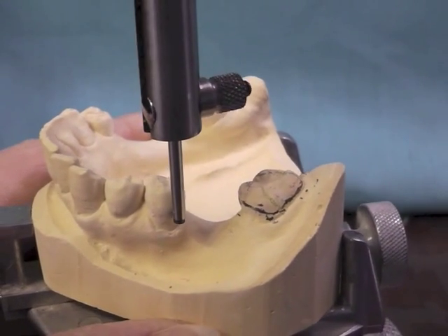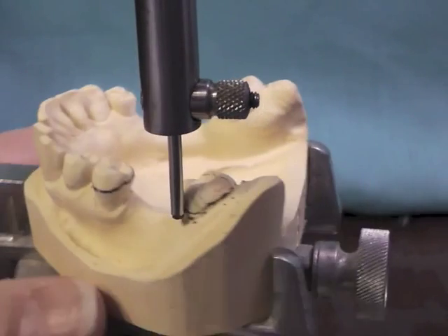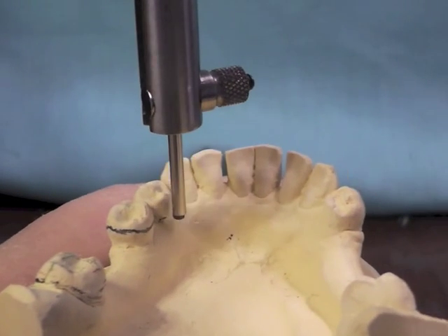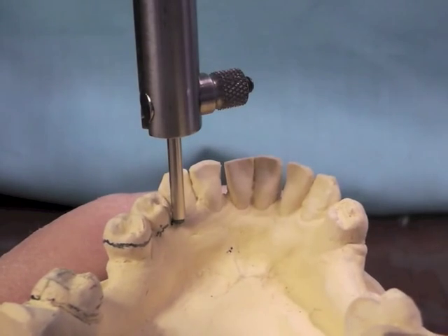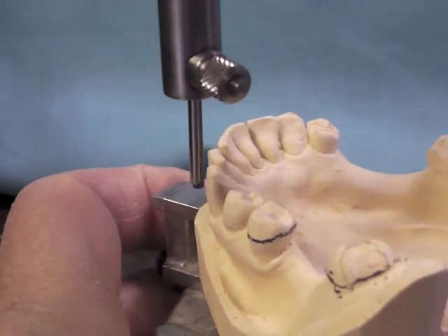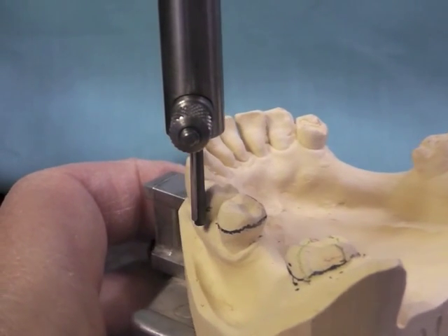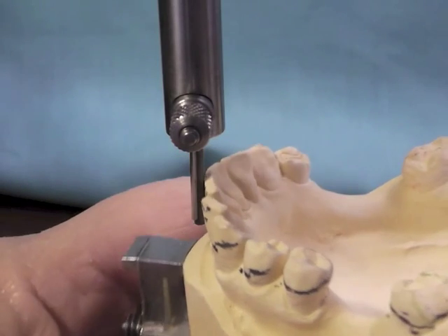We survey all posterior teeth and any teeth next to an edentulous area, and I like to survey anything that metal may cross. Again, keeping the lead at the gingival margin and letting the side of the lead make our survey line. I'm just going to come on around.